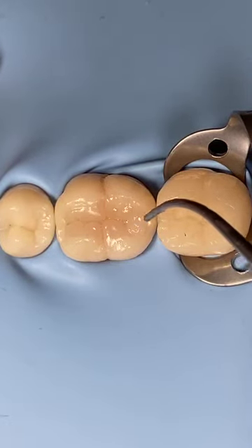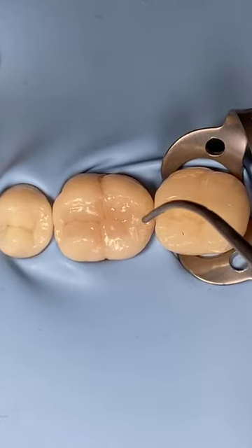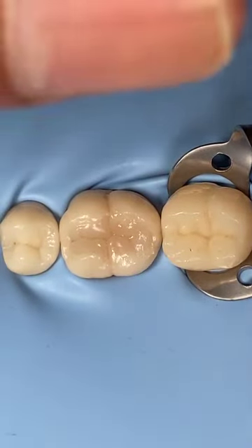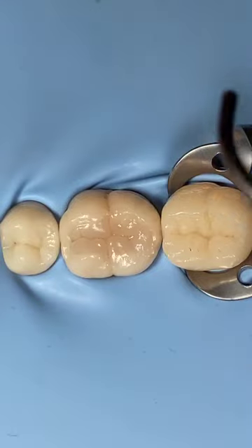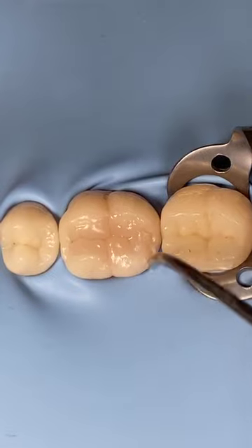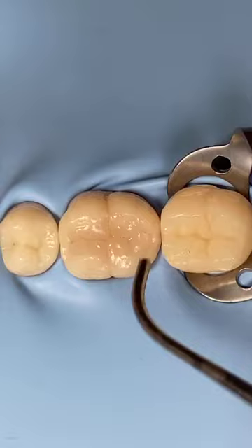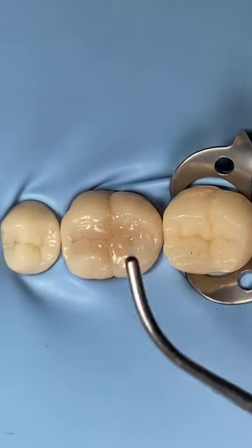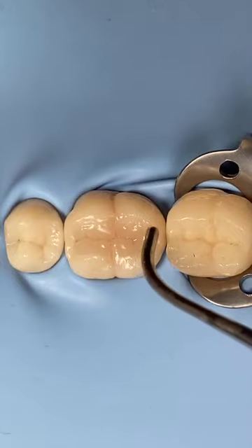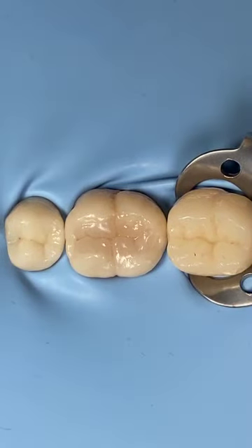Okay, put a big amount and then reduce slightly. In this step, maybe you can jump directly to the brush, but the bigger excess you have, the harder it gets to reduce only by using the brush, you know. So I'd like to reduce it first with the condenser, this instrument, with the plugger.